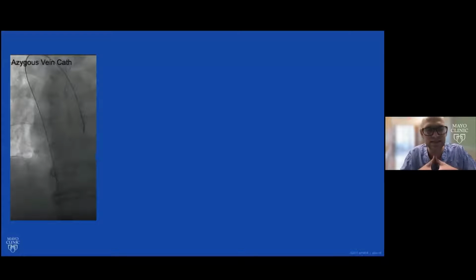So, for most of these lesions, we're talking about things in the thoracic spine. Just as an aside, about 80% of the patients that we've treated have been done under conscious sedation or minimal sedation. The patients that we treat under general anesthesia are generally patients that are uncomfortable. We're a quaternary referral center, so by the time people have gotten to us, they've been poked and prodded so much, and they just don't want to be awake for these procedures anymore. But 80% are under sedation.